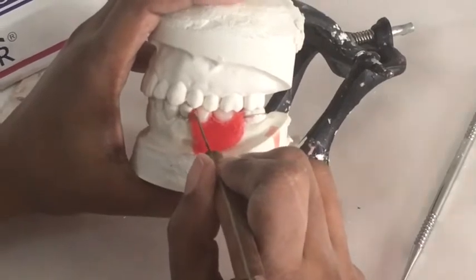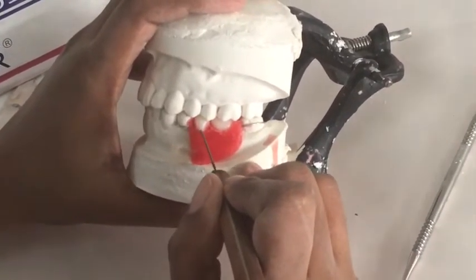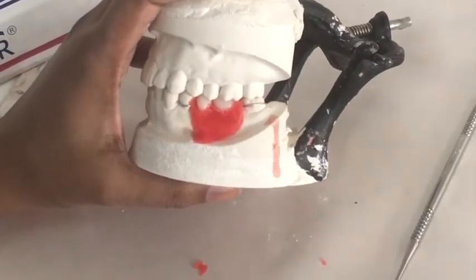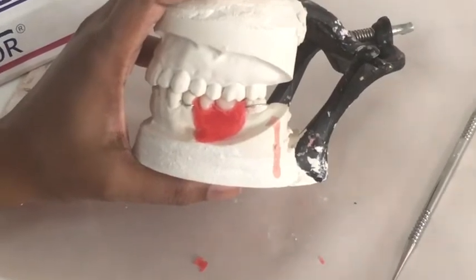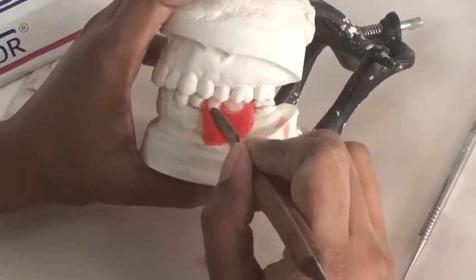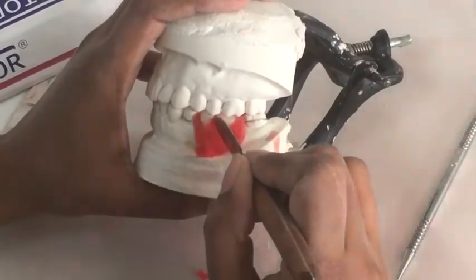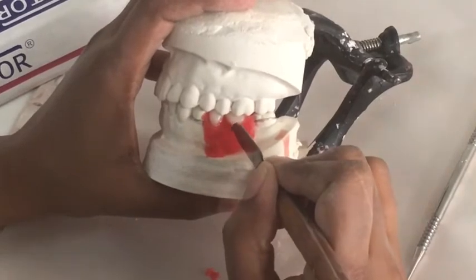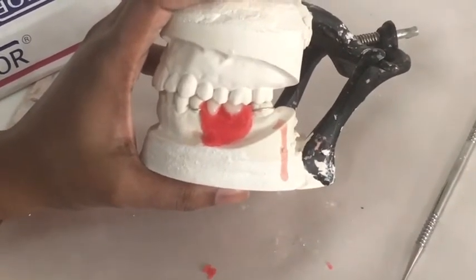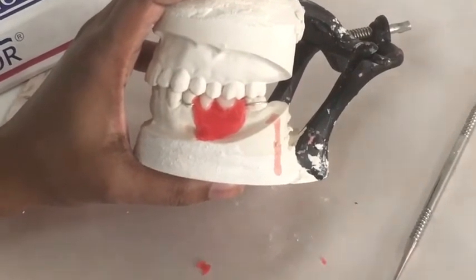Now you may remove the excess wax present on your model and give final touches to your wax-up. Make sure that there is no wax on the cervical third of your artificial teeth — try to give it as natural an appearance as possible.